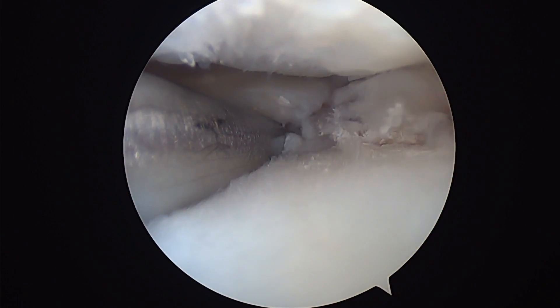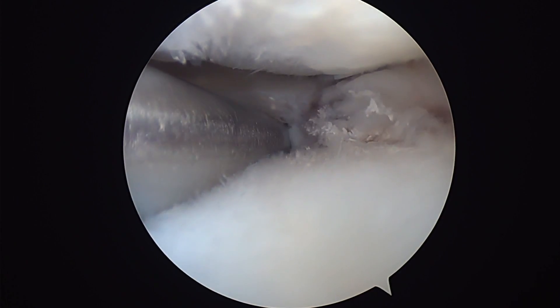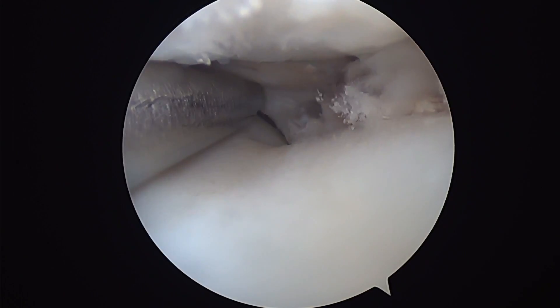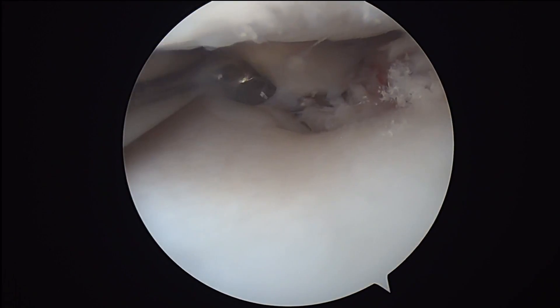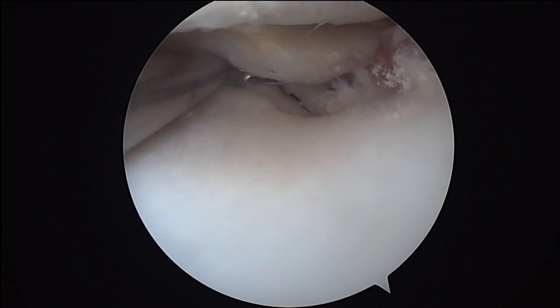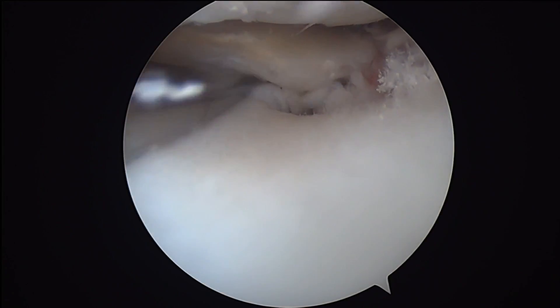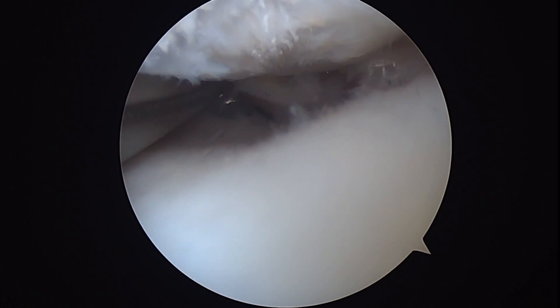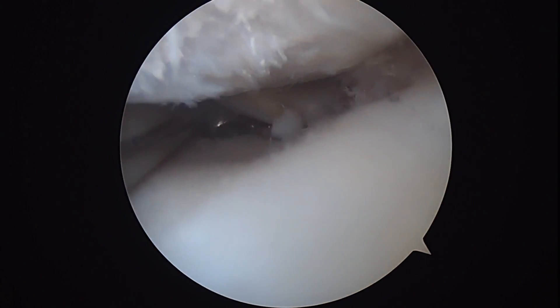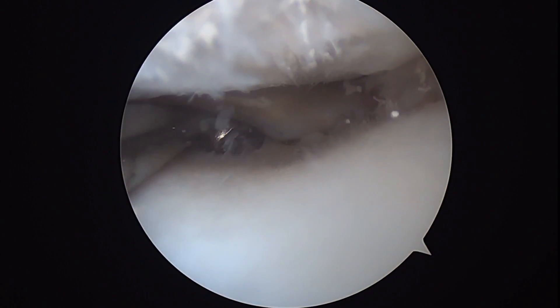Debridement of the root remnant is being carried out. Next, the root is determined to be mobile enough to undergo repair. Additional debridement at the site of the root remnant is made. Adjacent cartilage is then denuded down to the subchondral bone at the anticipated repair site, and a repair site just medial to the terminal end of the meniscus is chosen.